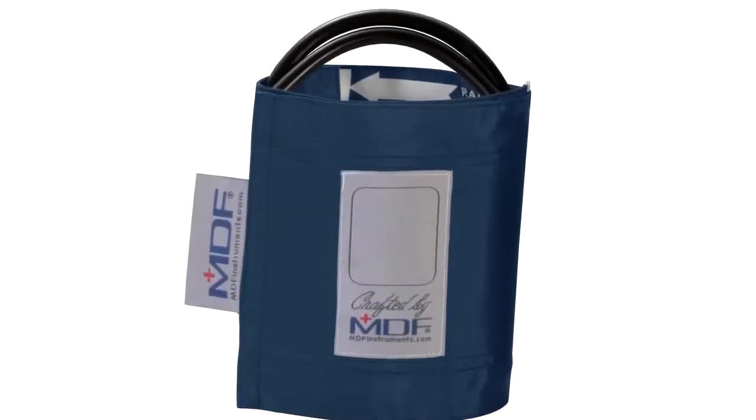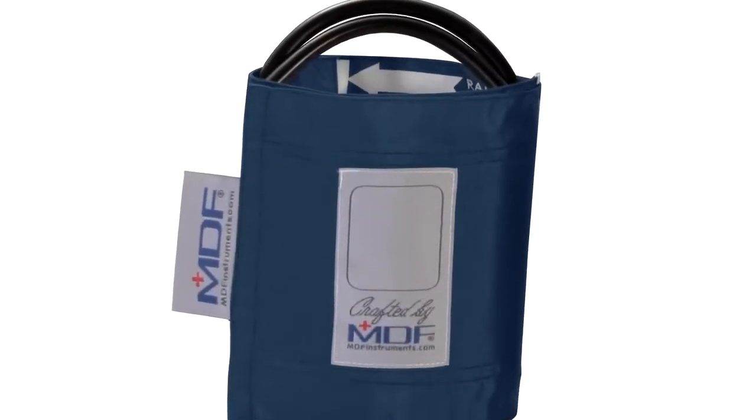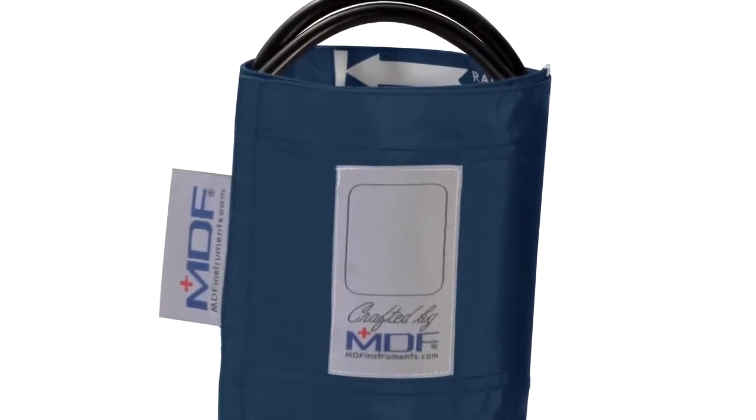And that's why MDF sphygmomanometers are among the most accurate and reliable on the market. The really nice thing about our cuffs is that the bladder and the tubing can actually be removed — they're not stitched in like you see with a lot of the other cuffs on the market. This means that our cuffs can be easily washed.